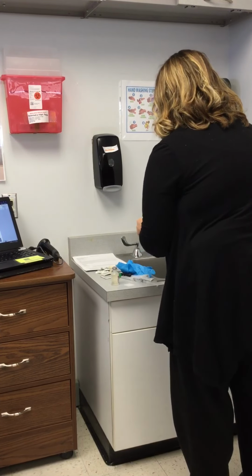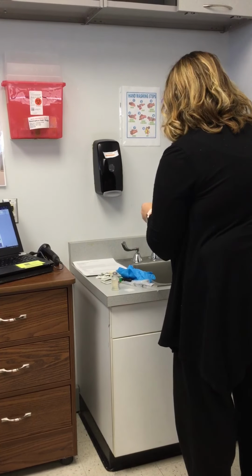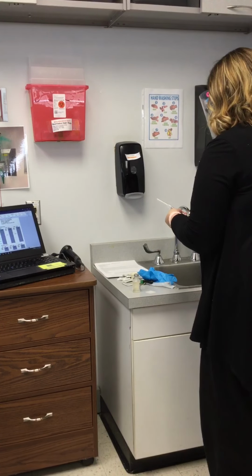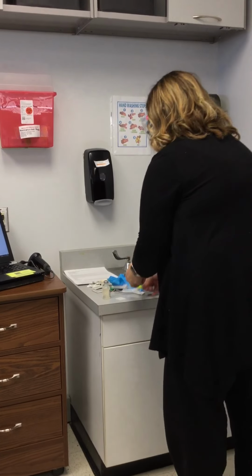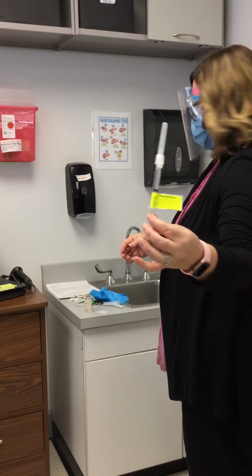On my syringe, I'm going to put the patient's name, what the medication is, the amount, and the date that I prepared it. And I'm going to put it down here so I can still see how much I have in the syringe. If I put it on the cap, it has the potential to fall off. So I'm going to put it below where I drew up the medication. Can you bring it closer to the camera so I can? Thank you.